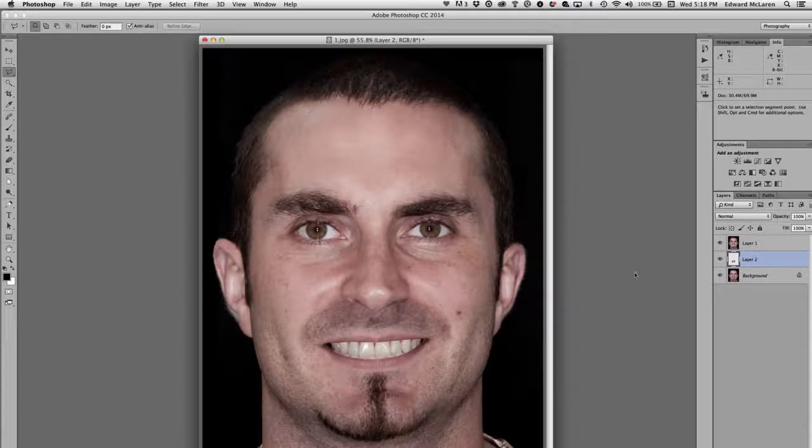But let's say now that you say, okay, I'm kind of liking that. He's kind of liking that. You're getting him motivated. Remember, this is just a motivational tool. This is all this is. This isn't occlusion or anything else. This is a 5-minute tool to get people motivated that you start doing your other things, your design waxing, your aesthetic prototypes or mock-ups, to start working out all the things we need to do functionally and finalizing your aesthetics.